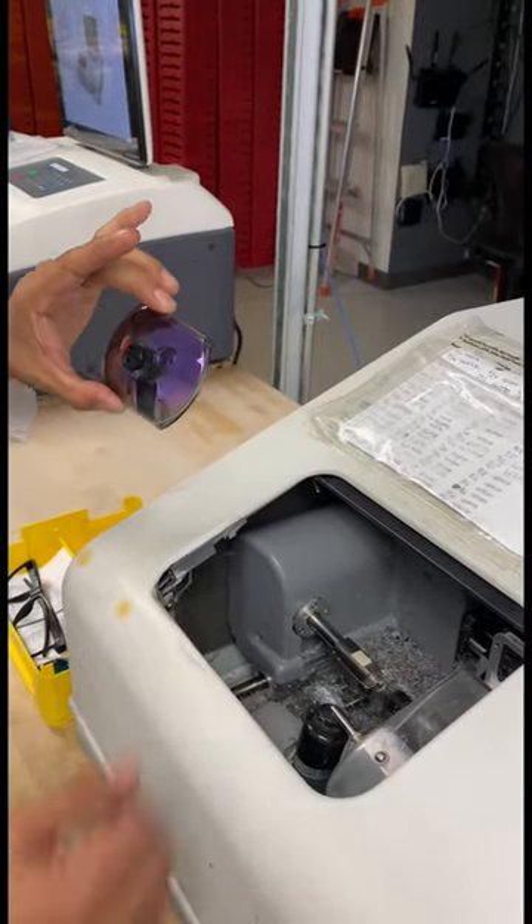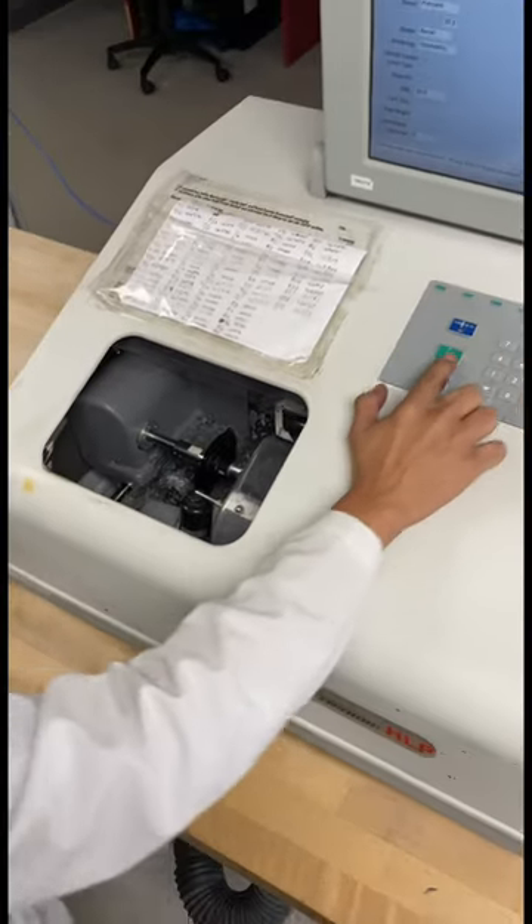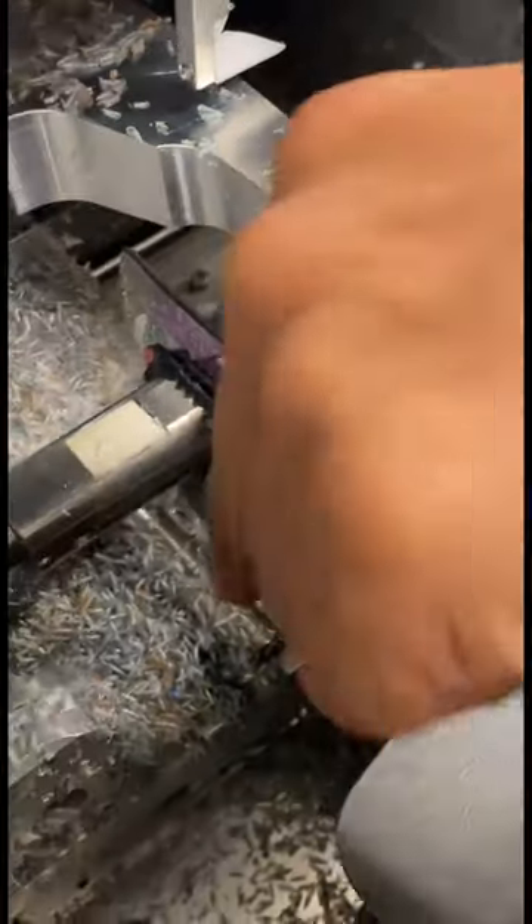Now it's time to cut the lenses. We pull the shape up that we traced into this machine, which is called an edger. The edger will first check to make sure the lens will cut out and use probe tips to trace the outside eye wire.